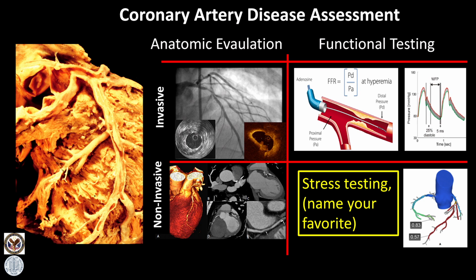The only one which we can really treat mechanically is that of the epicardial or R1 resistance atherosclerotic buildup, which you can see in the middle of this artery. And with that, we'll be able to determine perhaps the physiology of that stenosis to make the best decisions for outcome. So let's just look at the anatomic evaluation of coronary artery disease before moving to functional assessment.